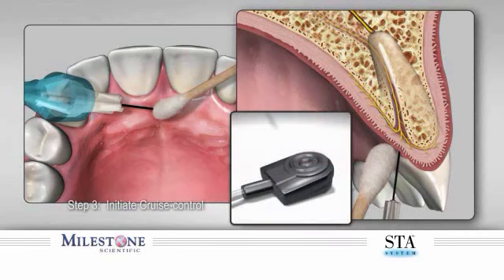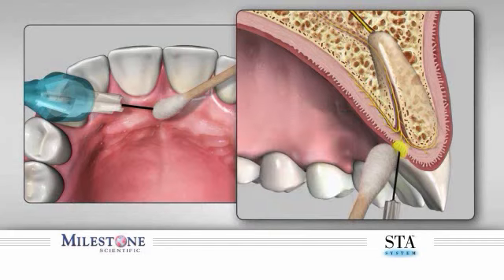Step 3. You now initiate cruise control by depressing the foot pedal and counting 3 audible beeps. After the 3rd beep, the wand system will announce the word cruise. Upon hearing this announcement, remove your foot from the top of the foot control pedal. You will find that the wand system will continue to beep, indicating anesthetic solution is continuing to flow.